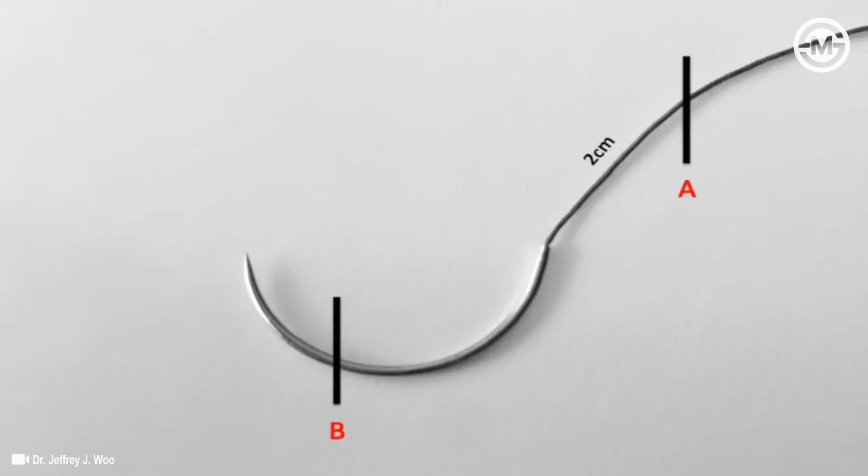Point B will be a point one-third from the tip of the needle — this will be our second grasping point. Lastly, point C, a point one-third from the hub, will be where our needle driver grasps.